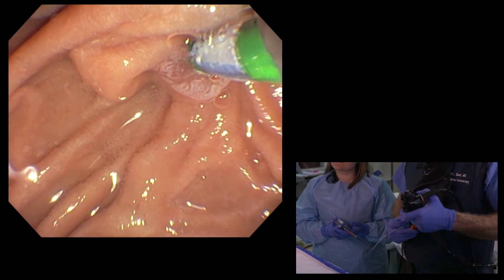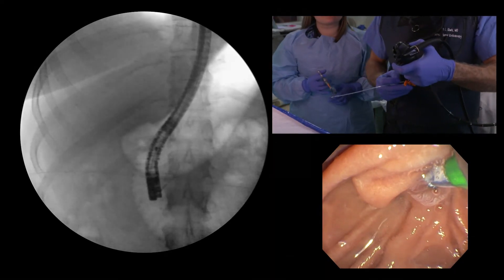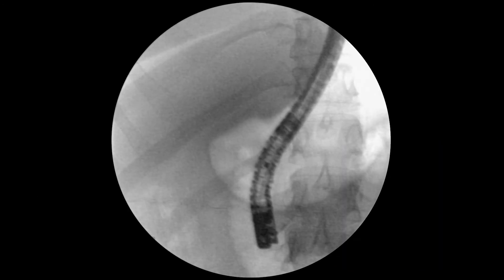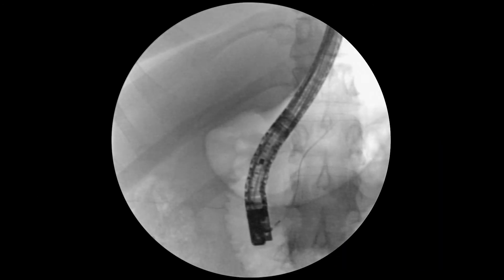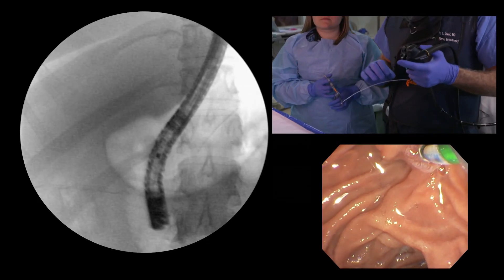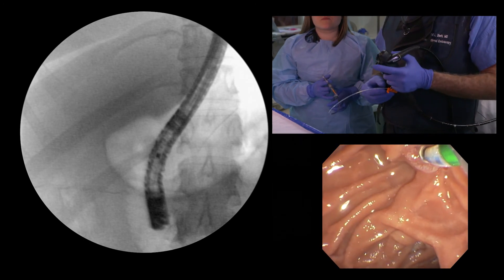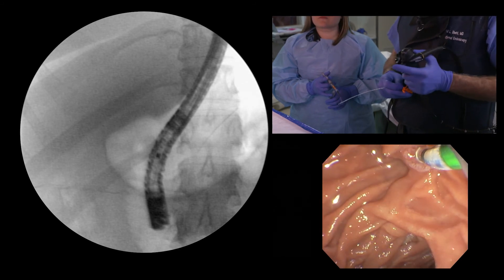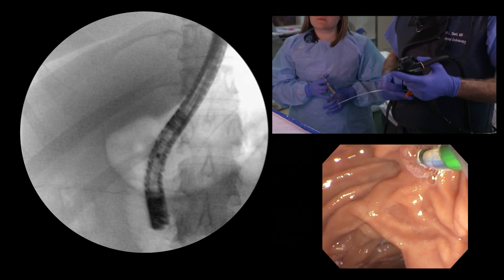The wire just went in. On fluoroscopy at MAG1, you can see that wire is crossing the spine — that is in the pancreatic duct. So I have several choices here: I could come out and try the other duct, I could put a pancreatic stent in, or I could use a dual wire technique. All reasonable.